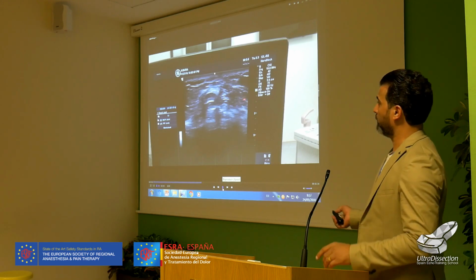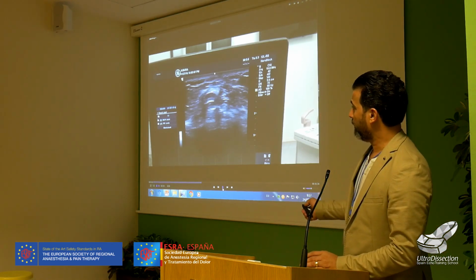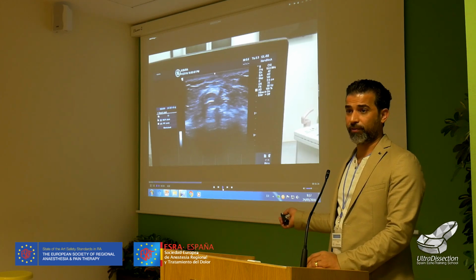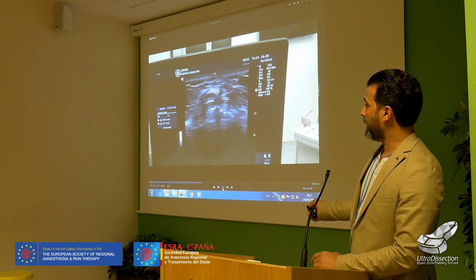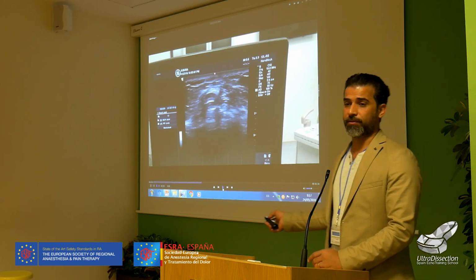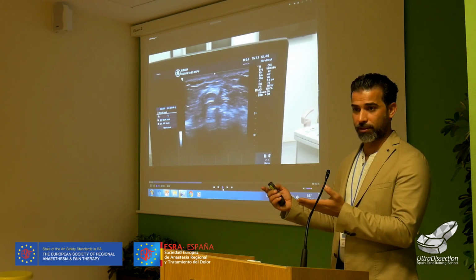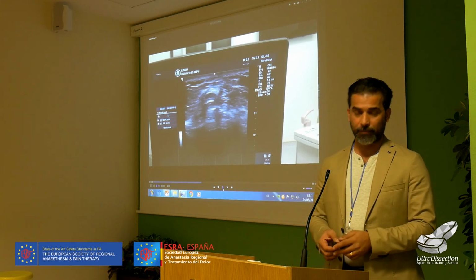See, this is unusual. Anyone do radial nerve in spiral groove? Now the radial nerve here, this is the hyperechoic structure that's been hypertrophied, or the fascicles are here with thickening, or double, like the diameter is the size of the nerve. This is from the scarring of the trauma itself, or also from the surgery, or from the delayed surgery. So here it is double entrapment of the nerve.